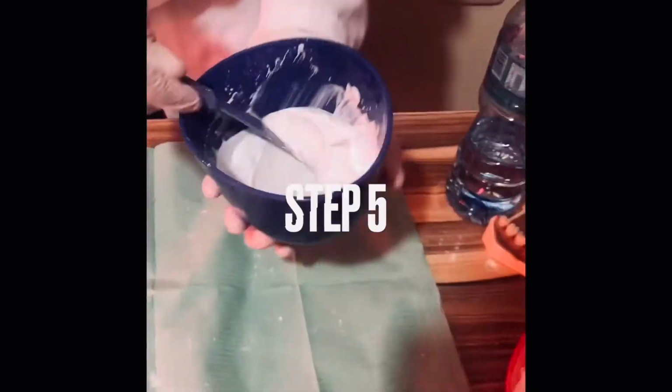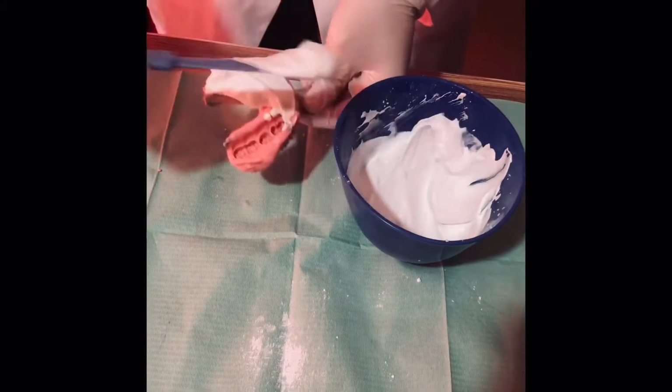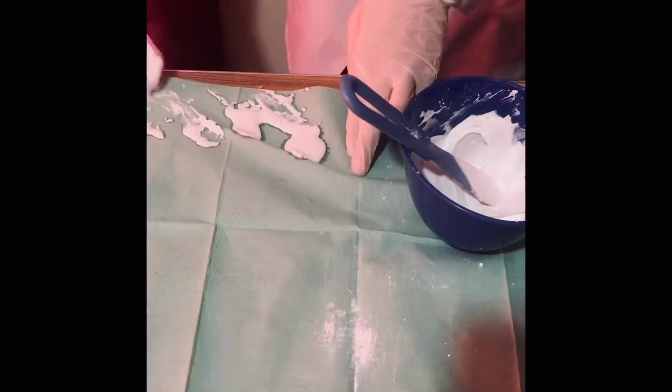After mixing the stone, pour it into the impression, as you see it. And then tap it on the table a few times to make sure all the air bubbles are gone.